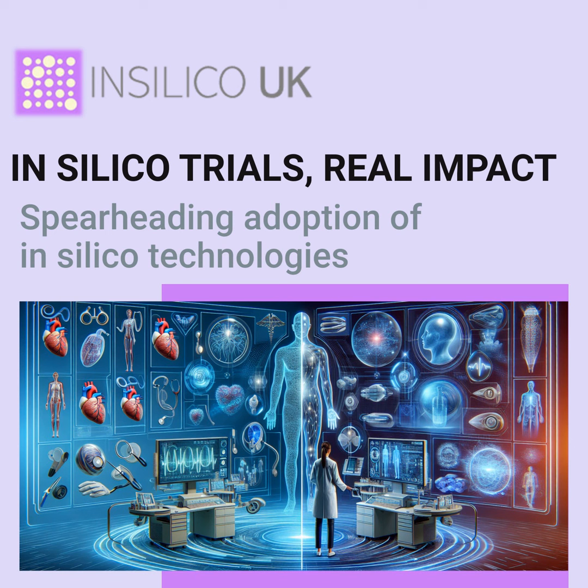Okay, so I'm picturing this virtual world. You can stress test an implant without ever actually having to build it. No operating room, no patients, just pure computational power. It's almost like a crash test, but for spinal implants, and all in the digital realm. Perfect analogy. Finite element analysis really is like a virtual laboratory. Engineers can apply forces, test different materials, and see exactly how a design holds up under pressure. It's been a game changer for the medical device industry.